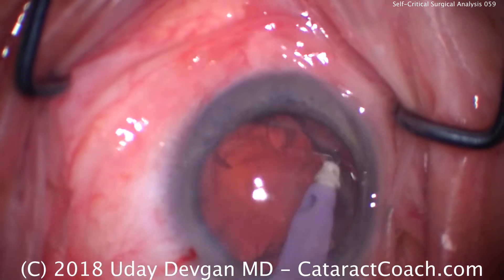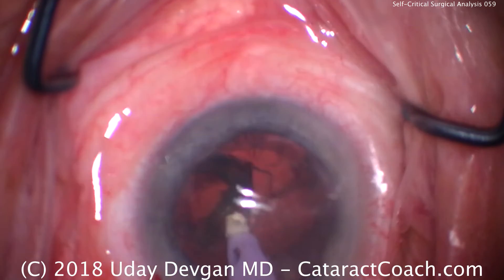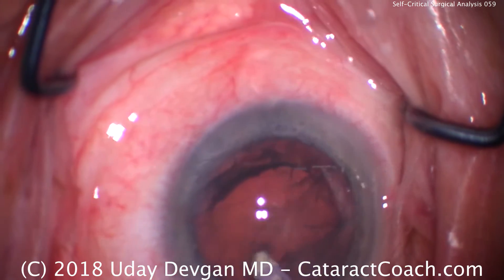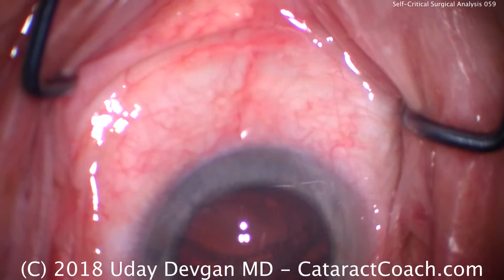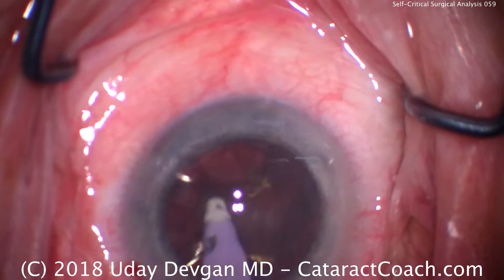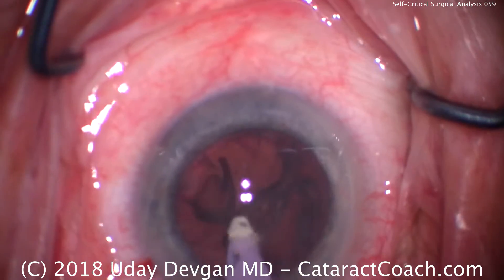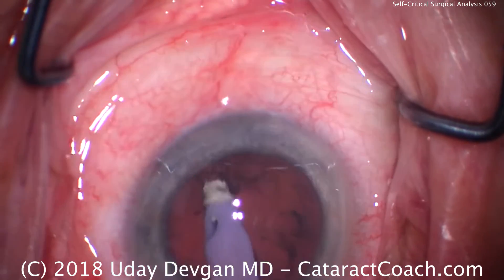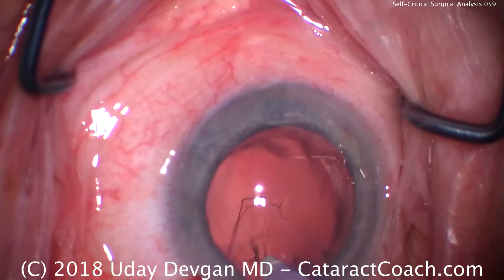It can still be aspirated with the IA probe — you don't have to use a phaco probe. There's part of that thick shell, and it goes down okay. But this is where we should have had better hydrodissection at the beginning of the case. Now I'll get under that epinuclear shell and apply vacuum with more confidence — and there the shell comes up. When the shell goes down, that's the end of it. Now we can actually remove the cortex. It would have been nice if we were able to separate that earlier.